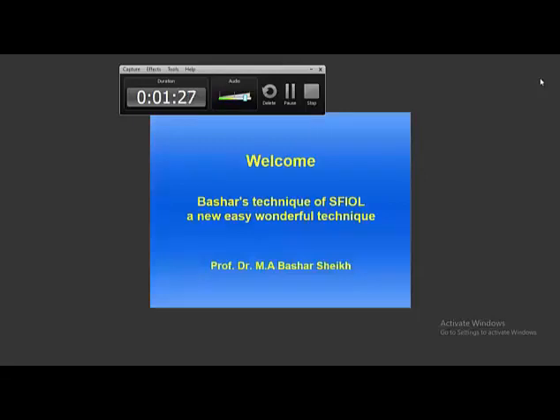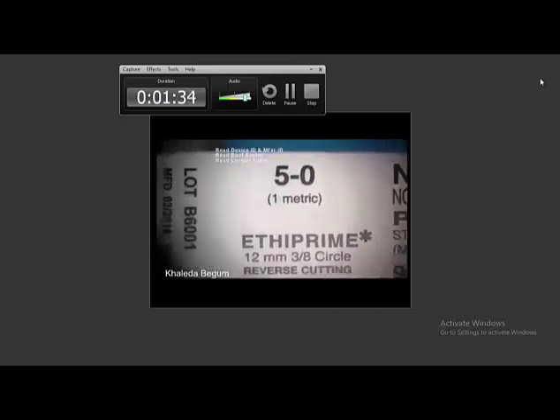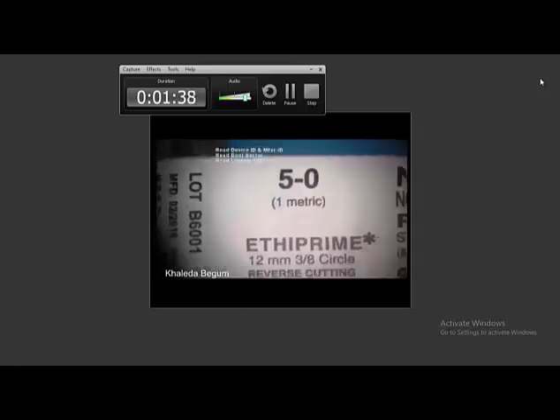You see how much trouble the anterior segment surgeon is facing. But in the posterior segment OT it is okay — the surgeon can try without facing any difficulties.